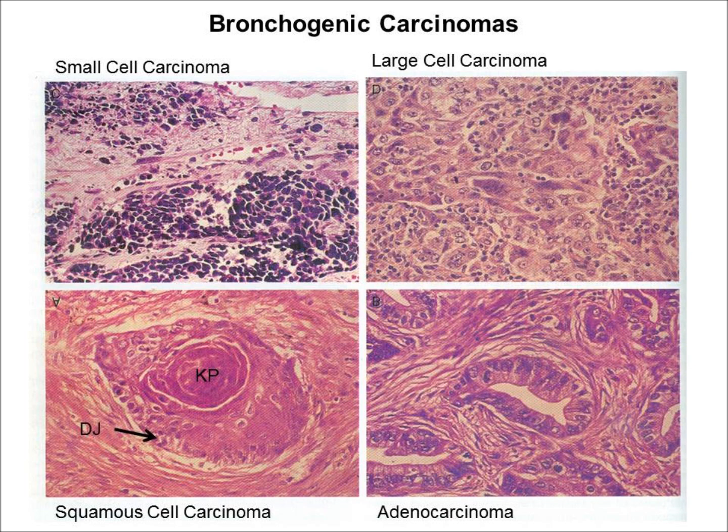This is a diagnosis of exclusion and probably represents squamous cell or adenocarcinomas that are so poorly differentiated that their origins cannot be determined.